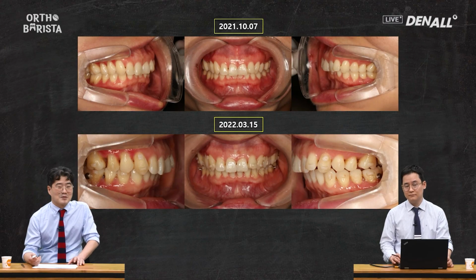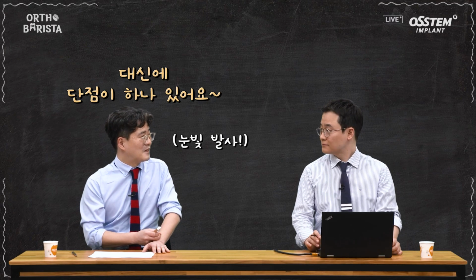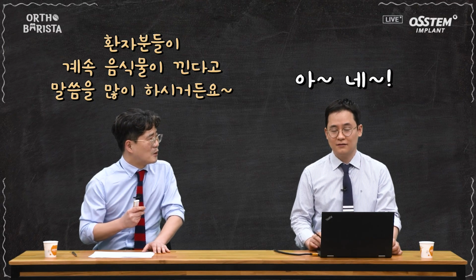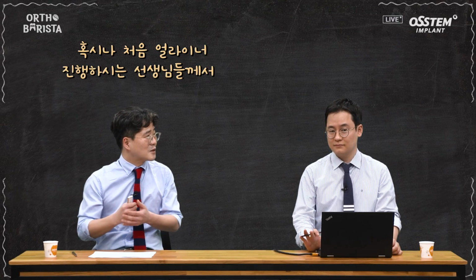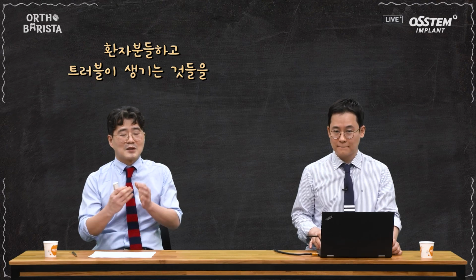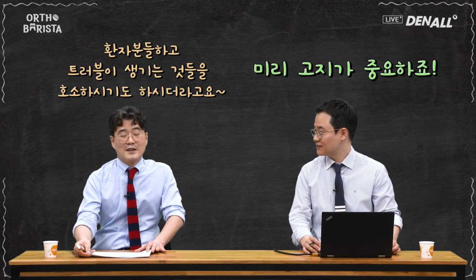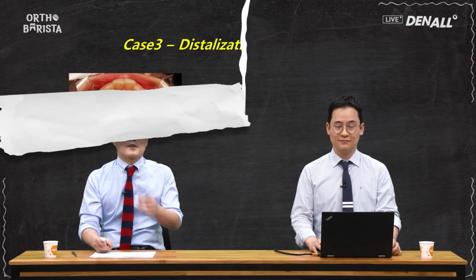Even though the movements are achievable, there is one notable drawback. A drawback? Yes, patients often mention that food gets stuck frequently. Clinicians who are new to aligner treatment are concerned about this complaint. Sometimes, these concerns can lead to conflicts with patients. This is why setting expectations beforehand is so important. By informing patients in advance, many of these issues can be mitigated.